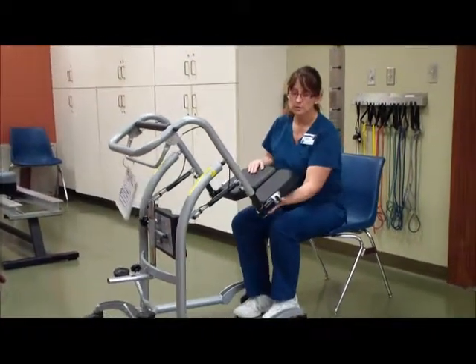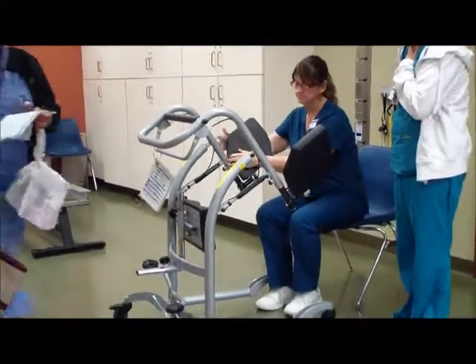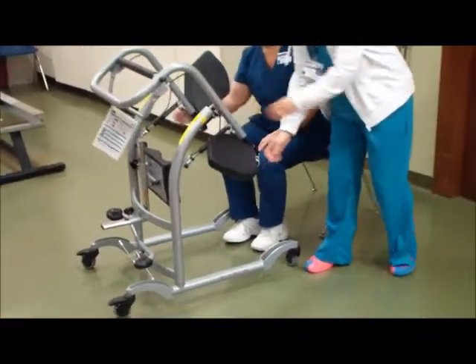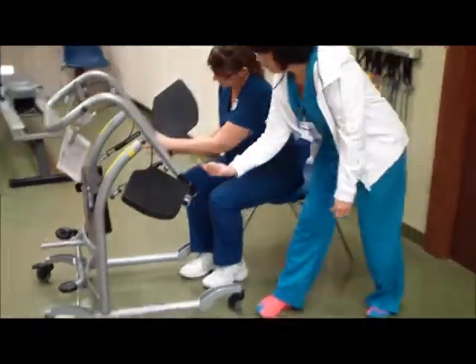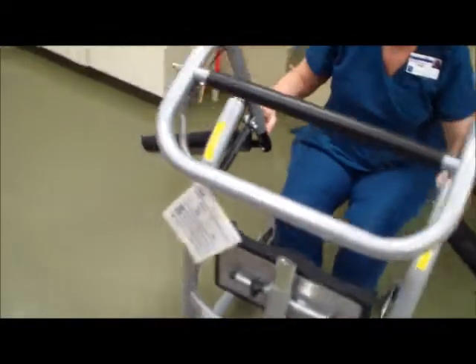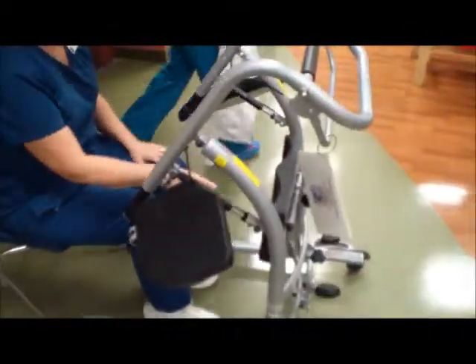So it flips up. And then you can also move it out, to rotate it out of the way. You have to push it up. Just push straight up, and then it turns. Turn and burn.